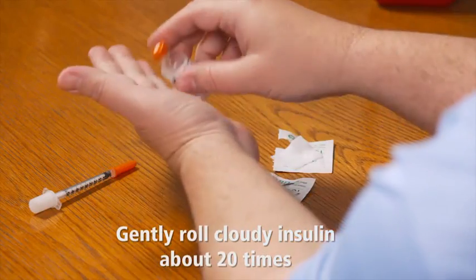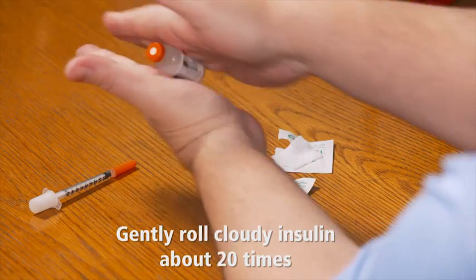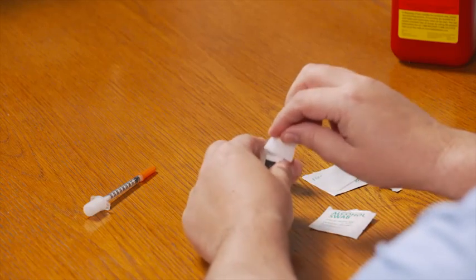If the cloudy insulin looks okay, gently roll the bottle between your hands about 20 times until the liquid is well mixed and has an even look. Be sure never to shake your insulin — that could create air bubbles or even damage it. There's no need to roll the clear insulin. Next, use one of the alcohol swabs to wipe the top of both bottles, then let the alcohol air dry.